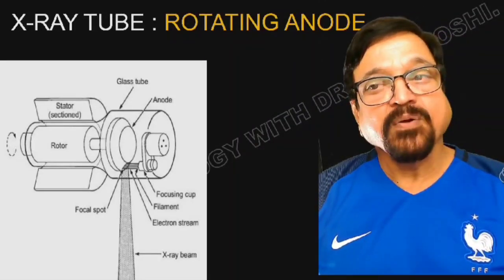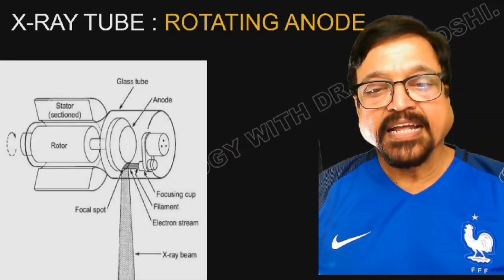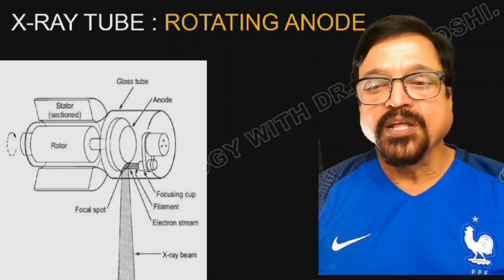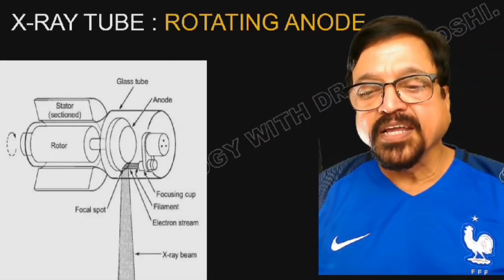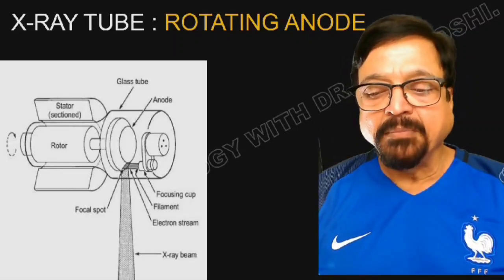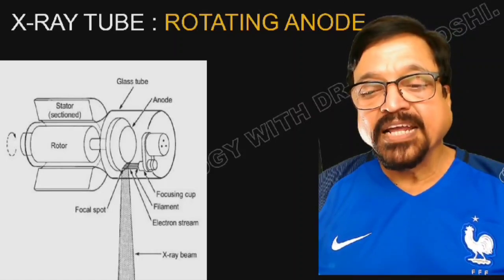Now let us see another. It is the rotating anode. We have seen the stationary anode. Now it is the rotating anode. See the difference. It has a rotor. It has a stator. Then it has a glass tube that is common to both. Then it has a focus spot that is common to both. The focusing cup is common to both. The filament is again common, and the electron beam is common.